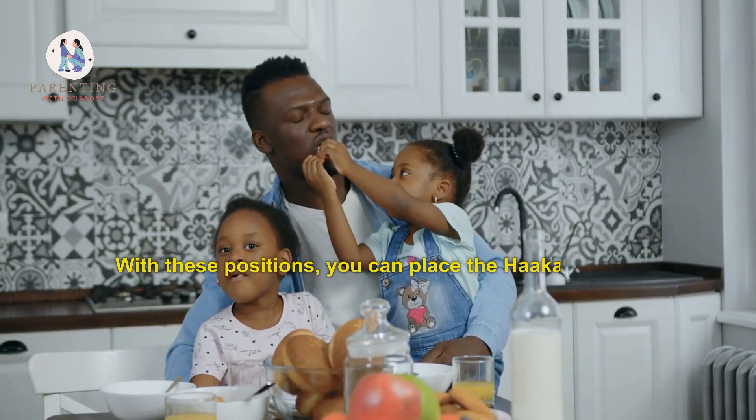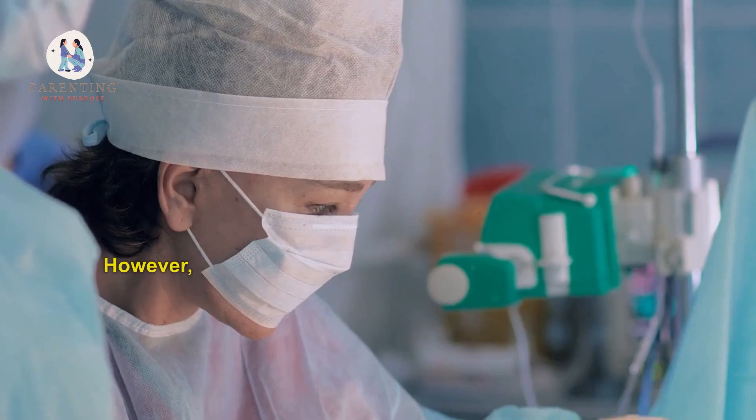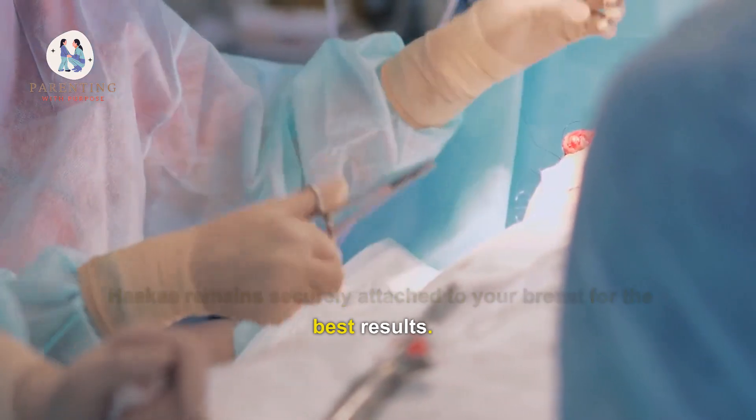With these positions, you can place the Hakaa beside your baby instead of on their body, allowing them more freedom of movement during feeding. However, it is important to make sure that the base of the Hakaa remains securely attached to your breast for the best results.